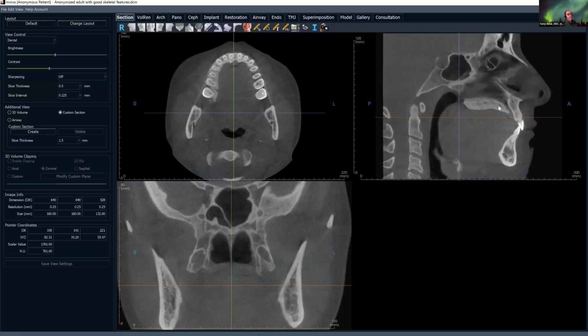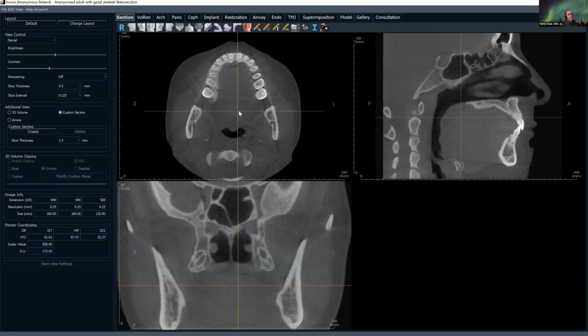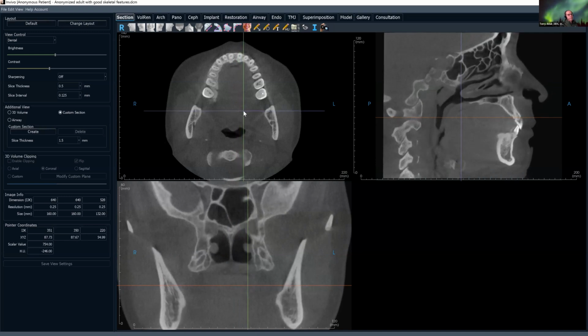About the same time, you're going to see the nasal septum. It's very thin in this view, and very, very commonly, patients have a deviation, so you may not see that full nasal septum as you scroll through the midline. You're going to get the sagittal view of the frontal sinuses. I continue to scroll, and now we've passed through the midline. We're going to expect to see the same on the left side. I look at the ethmoid air cells.